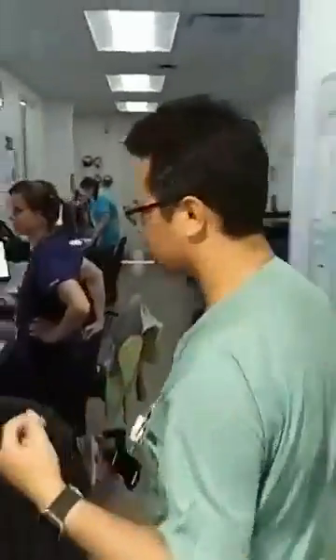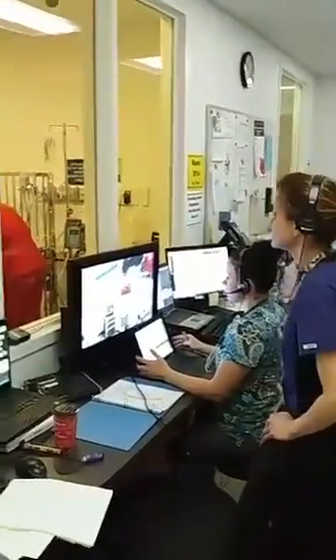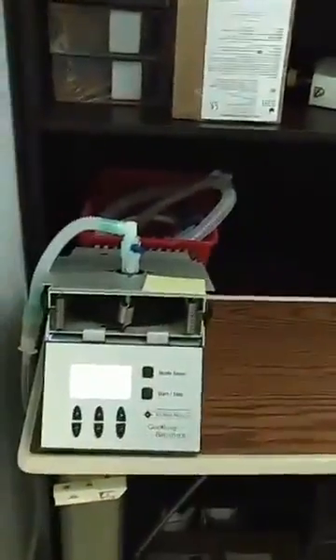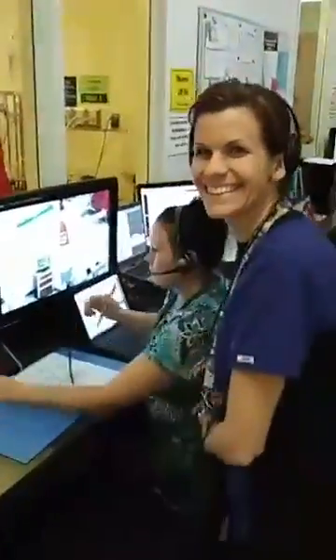We're going to go into the control room now. Just to set up, this is our control room where we can control the physiology, we can control the recording of the events so that we can review them later. We also have a couple lungs over here that are acting as spontaneous breathing mechanisms for some of our patients inside the room. Over here we have Jen Barton, our manager of clinical practice.